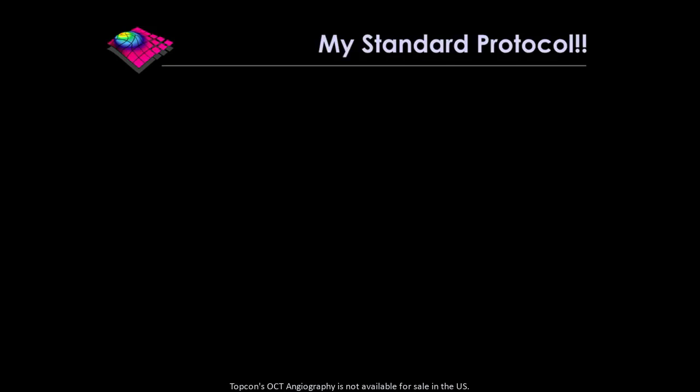Now, so what I've done is I have a standard protocol in place for my patients who come, and essentially I get this protocol on every patient with moderate and above diabetic retinopathy, moderate non-proliferative, severe non-proliferative, and all my proliferative diabetic retinopathy cases, every time.